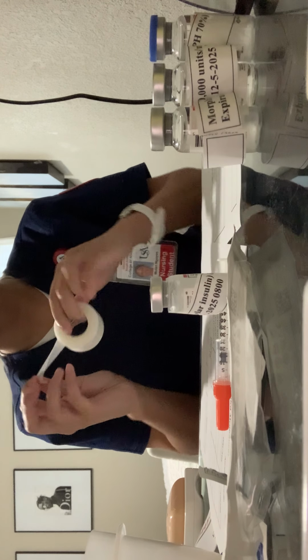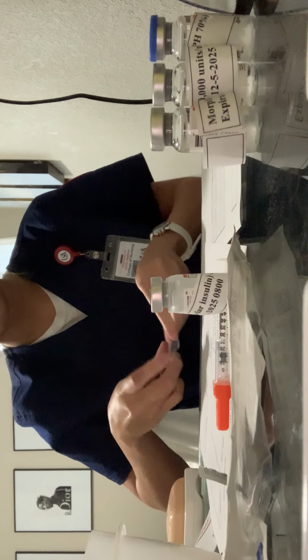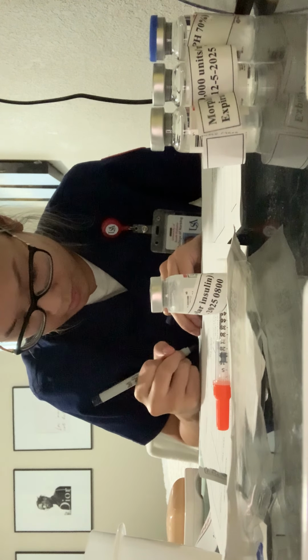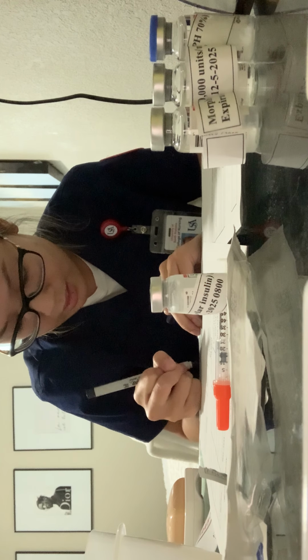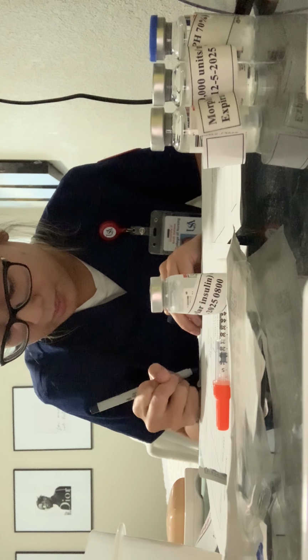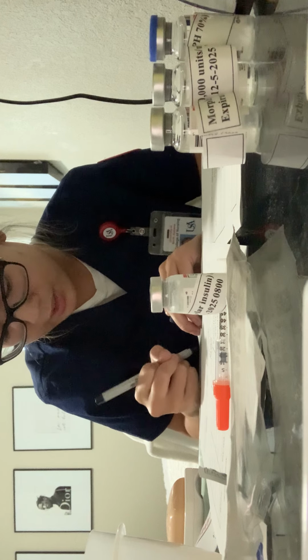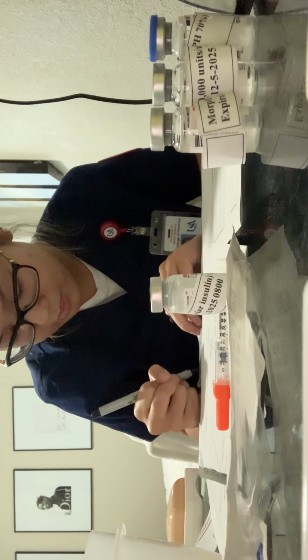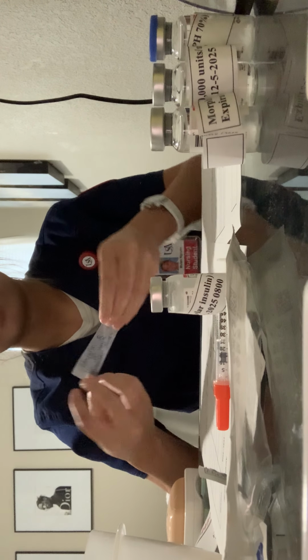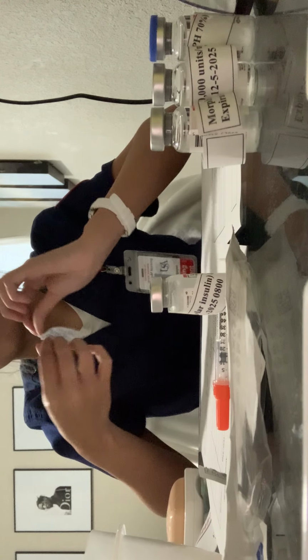to put my cap back on, and I'm going to prepare a label with some tape. And on the label, I'm going to write the drug name, so Novolin R, the right dose, 10 units, and the patient's name, Jaguar Jones. So I'm just gonna show the label, and I'm gonna put on my syringe.